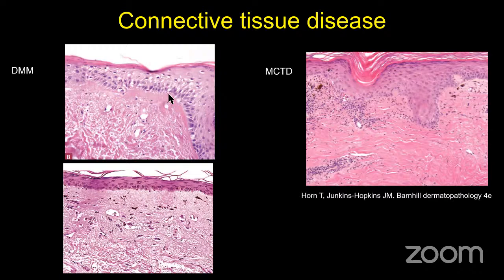You can see all the vacuoles here, the alteration of the basal keratinocytes. Here, the basal layer sort of isn't even here again. Again, we have the spinous layer just sitting on the dermis, so you can tell there's been disruption. And at first glance, you might not think that there's anything going on here, but one of the clues is going to be the presence of pigment incontinence. So anytime you see that, you want to look above to see if there's any sign at all of an interface reaction. And hopefully you guys can see this. Since I'm not looking at your faces, I can't see if you're nodding or giving blank stares, but there's a little bit of interface reaction here.